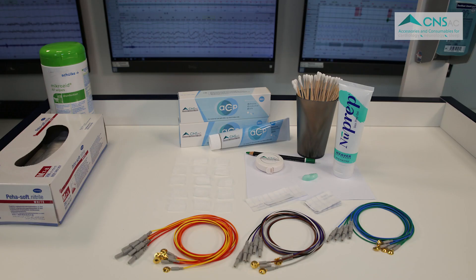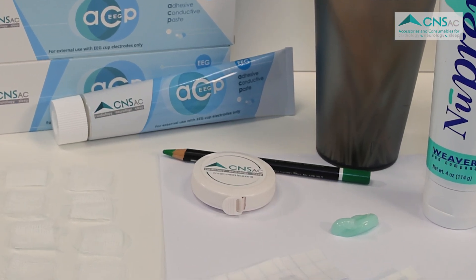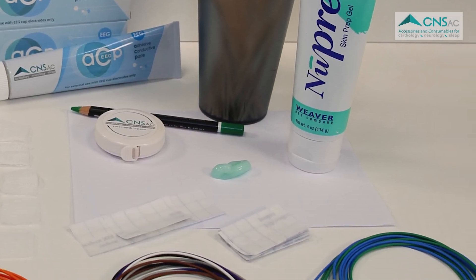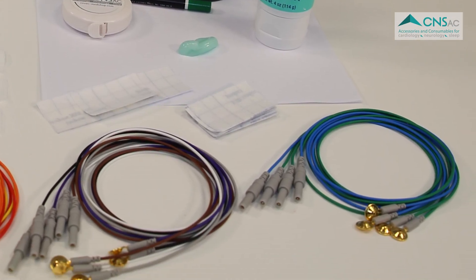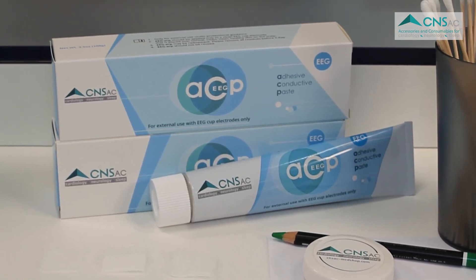To apply the electrodes to the scalp for EEG or PSG examinations, you will need a tape measure, a marker to highlight the EEG electrode position points on the scalp, an abrasive gel to prepare the skin, EEG cup electrodes, and an adhesive conductive paste like EEG ACP paste to attach the electrodes to the scalp or face.